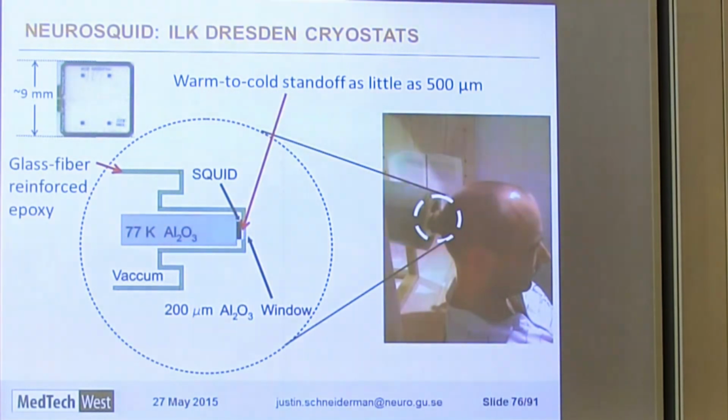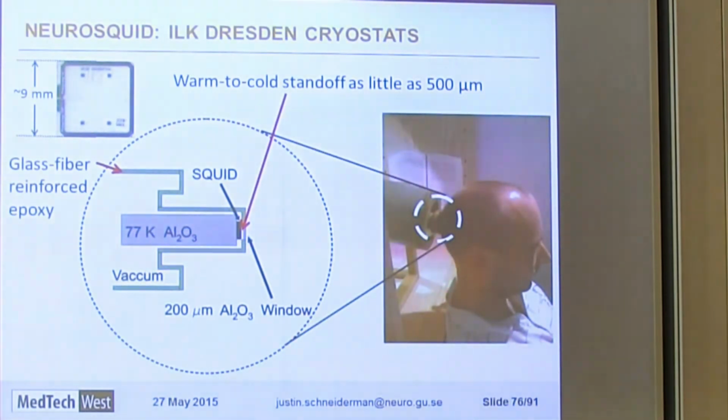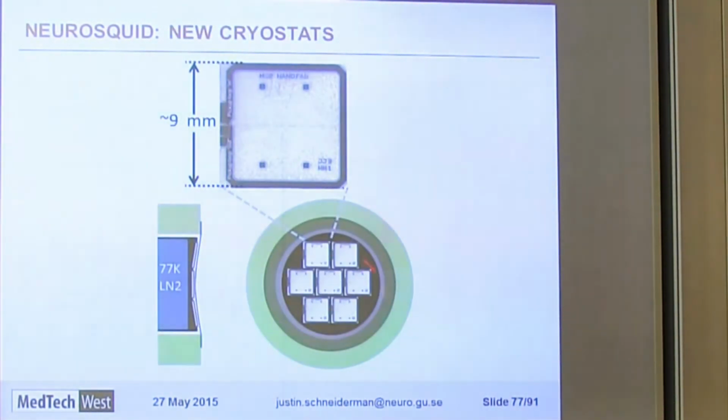And what we've been doing for our MEG recordings is putting this into one of these cryostats and trying to bring it very close to the room temperature environment. The next step, though, is to build new versions of these cryostats that can house more channels. So in this case, we've started with designing a 7-channel system in which the squids themselves are tilted with respect to one another, aiming to match more or less the average curvature of the head. And that way we can start doing multi-channel MEG recordings of brain activity.